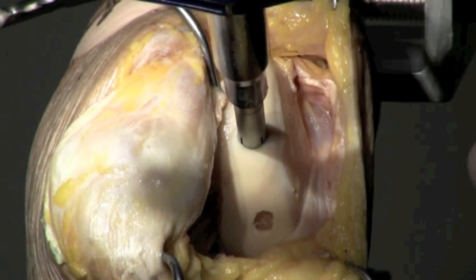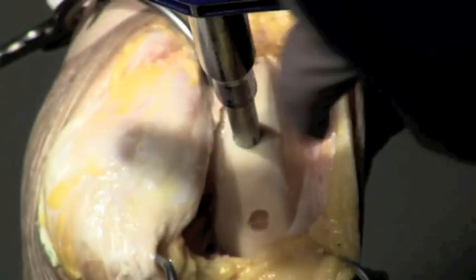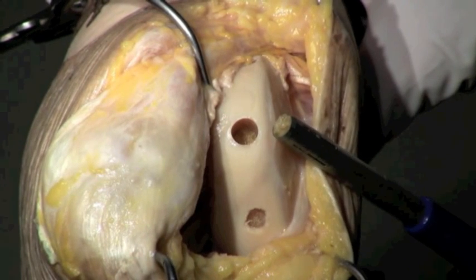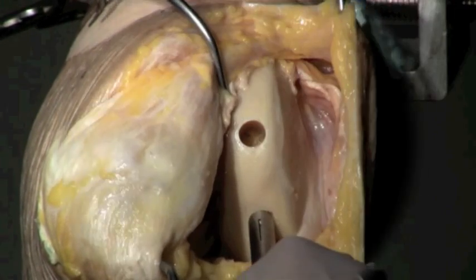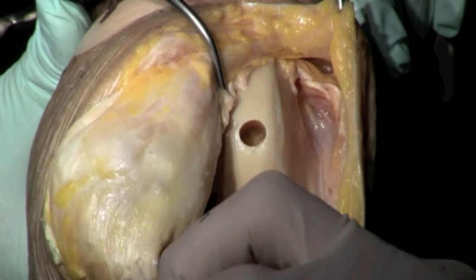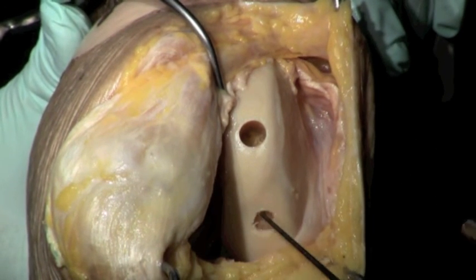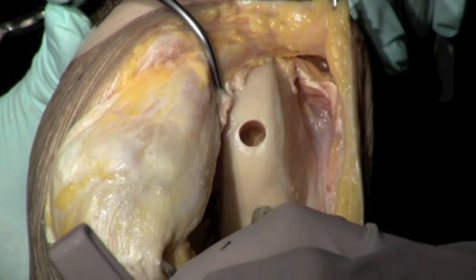We're down to the right depth. We're going to try to get one fragment out of this. So we turn, and here we go. Here's the defect that we've created to fill the area on the weight-bearing surface. So I'll go ahead and create a recipient site that gets all the way around this site and then some, in order to make sure that there are no areas that are not covered by this.